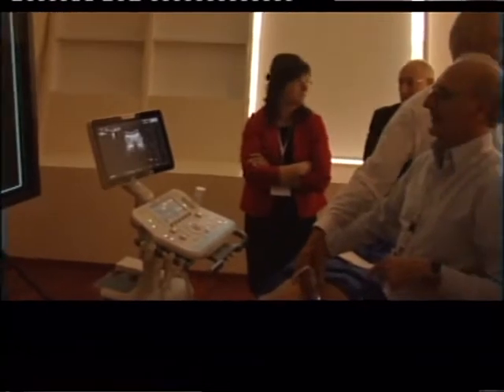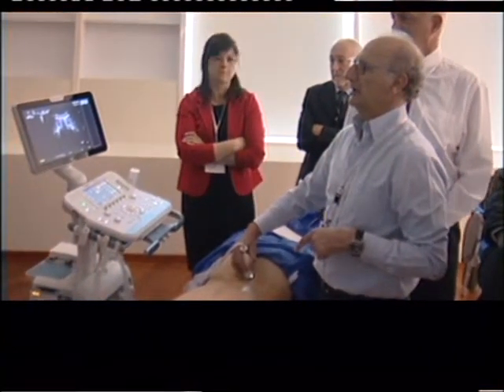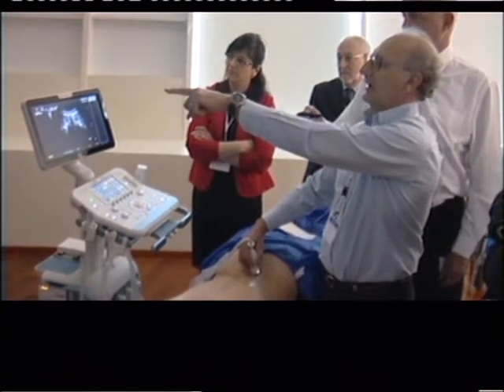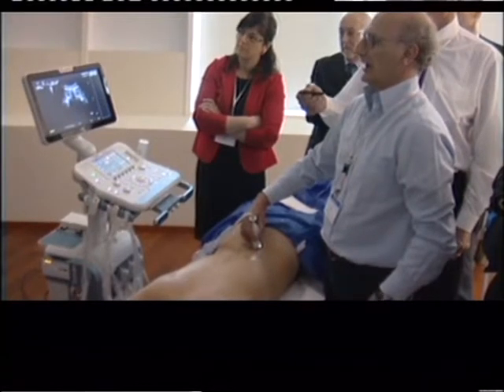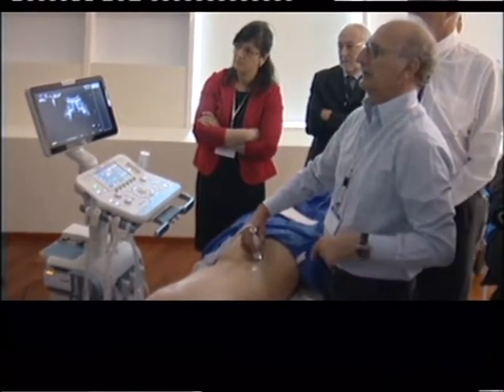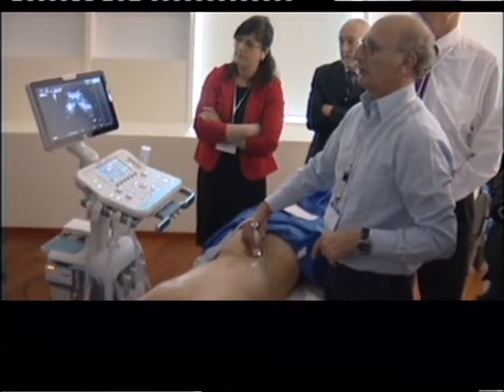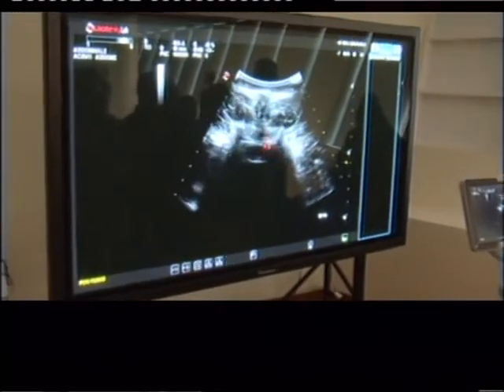Okay. So let's go and do the fifth lumbar, fourth lumbar. This first lumbar. This is a facet, interarticular, there. And this is spinal canal. And then this is longitudinal ligament. All right. Now let's go up one more. The second. Now you can see there's the spinal canal again. The facet. Here.